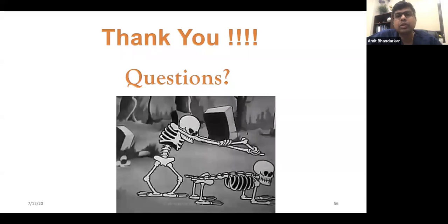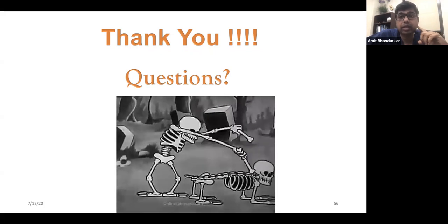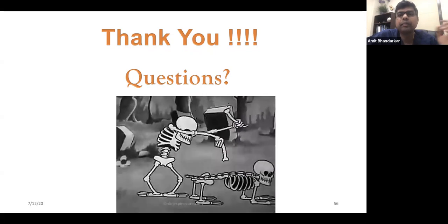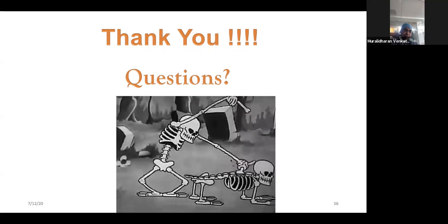I'd think the cage will be excessive. But at that point of time, I may think, does the patient have a chance of having a pseudoarthrosis? If yes, I may say, okay, let's go ahead and possibly do a cage, because that will maximize or optimize the fusion potential. Yes, it's selection criteria.